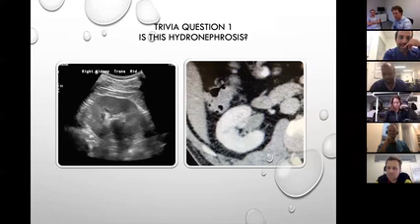Nothing. We're going to call that unnecessarily hydronephrosis. You just got to make sure you're not calling that hydronephrosis when it's an extrarenal collecting system. That's right. It's just an extrarenal pelvis. This guy was just last week.